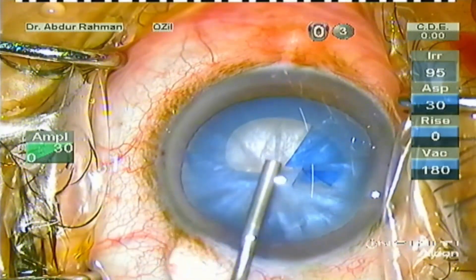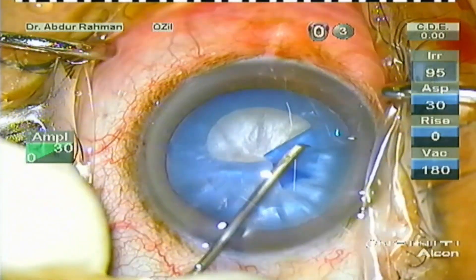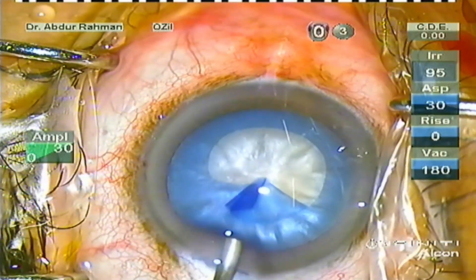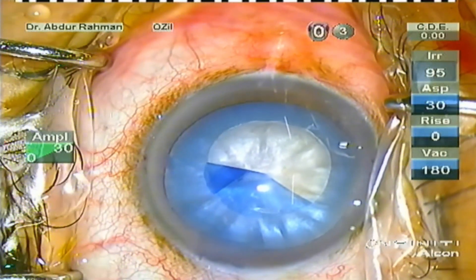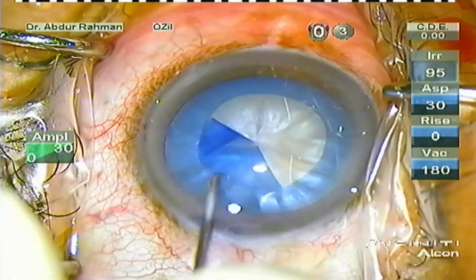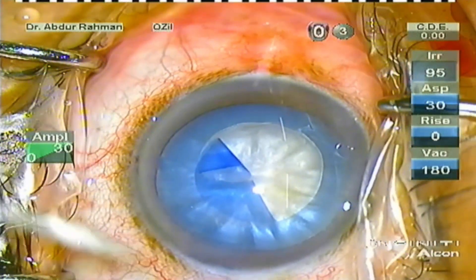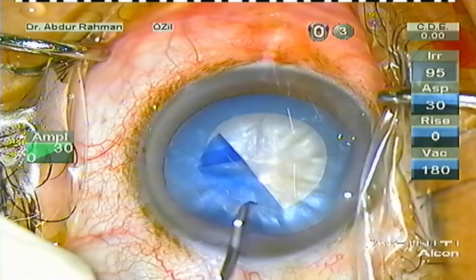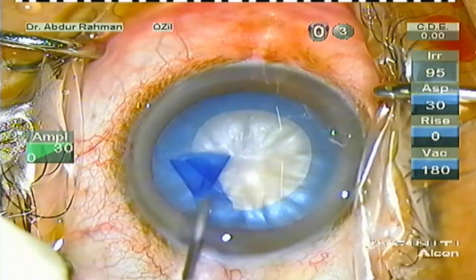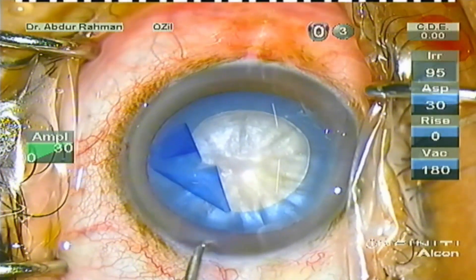In white intumescent cataract it is best to do double rhexis — a primary small rhexis followed by decompression of the bag, then enlarging the primary rhexis into a secondary larger rhexis. But in this case the rhexis was behaving, and when I incised the anterior capsule there was spontaneous decompression of the bag. Some liquefied cortex came out, so I was confident that the rhexis will not run out and cause the Argentinian flag sign.